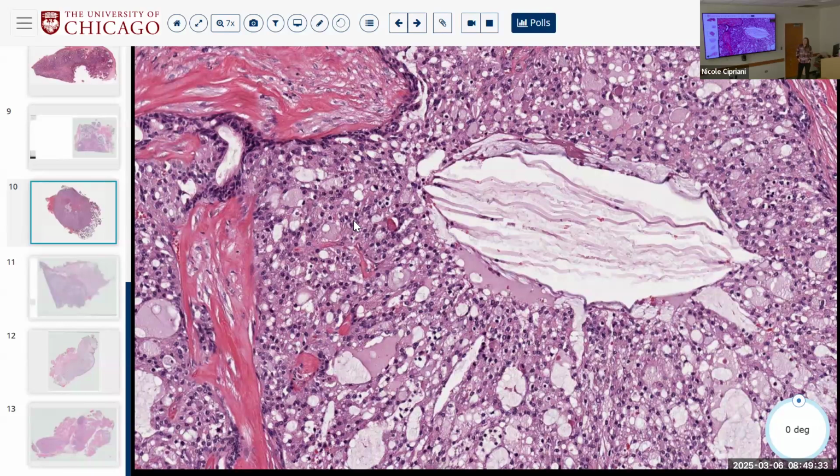Most salivary tumors are GATA3 positive with rare exception, and I have a chart somewhere I can send to you. But GATA3 to me does not help, because a lot of them are positive, because salivary and breast tissues express similar immunophenotypic markers. Mammoglobin is the one that is unique. Mammoglobin is only positive in a very small subset of salivary tumors, unlike GATA3, which can be positive in many. Okay, so this is secretory.